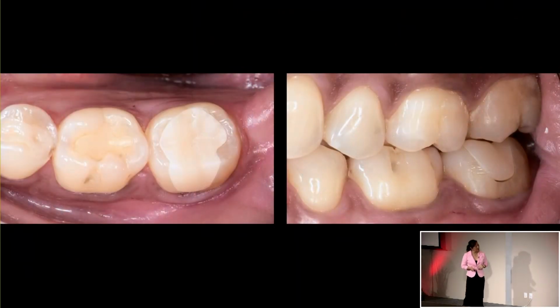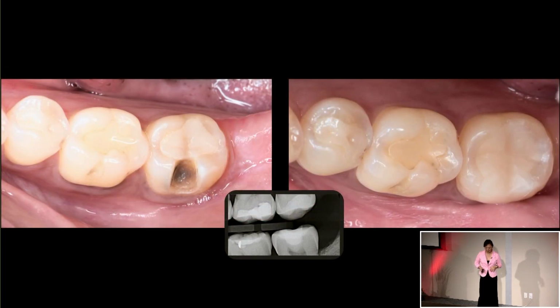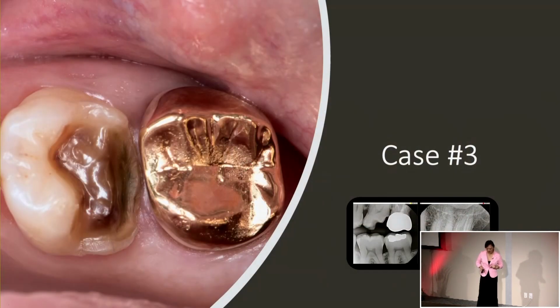And I try in the restoration, make sure that it's passively seating down. I do not make any adjustments to the occlusal contacts until after it's seated. If you start making adjustments, because right now it's not bonded, it may cause it to fracture. So you want to be very careful not to make the adjustments right away. And once it's bonded, then I make my adjustments, make sure that everything is right. And Latonia was very happy to receive her restoration same day. She's happy, I'm happy.